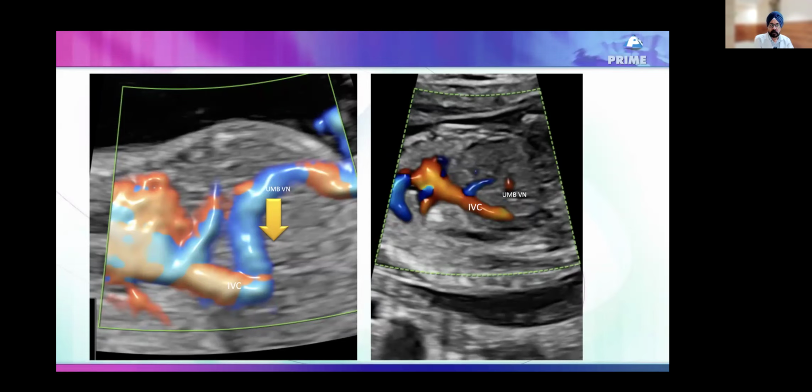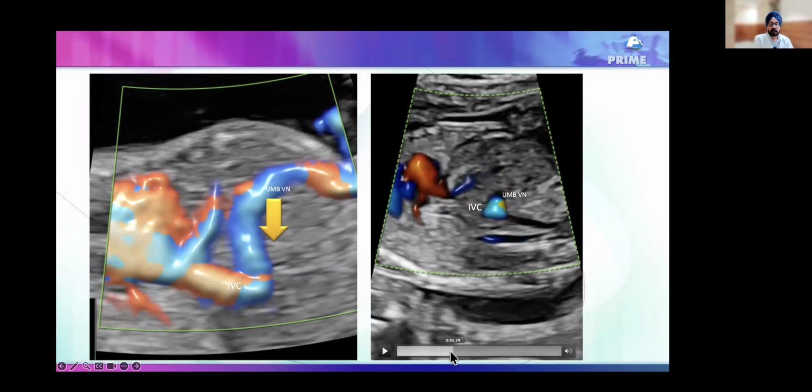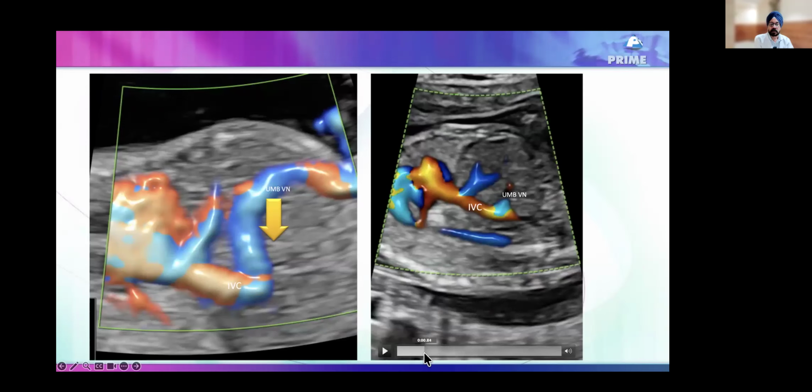So you look for scimitar syndrome when you are having this view, where you see the descending aorta sagittal view and inferior vena cava. This is where you look for normal right lower pulmonary vein and abnormal PAPVC, which opens into the inferior vena cava or hepatic veins, and it is called scimitar syndrome. Scimitar is important, causing hypoplasia of one part of the lung, and then there are a lot of AV malformations or sequestration happening in the lung.